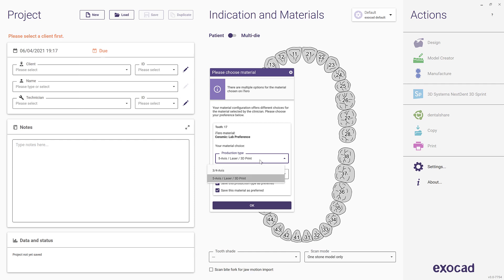In addition to the material, you can choose the production method, for example, 4-axis milling versus 5-axis milling, and save as default.